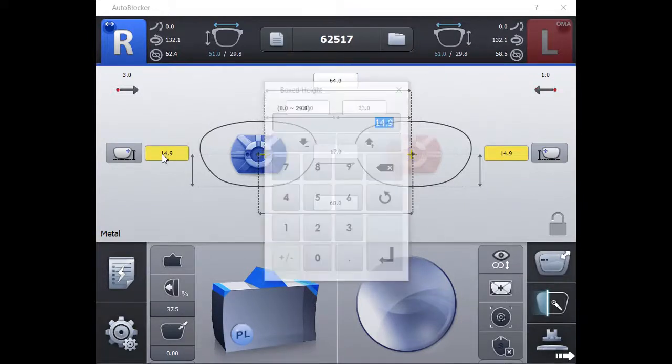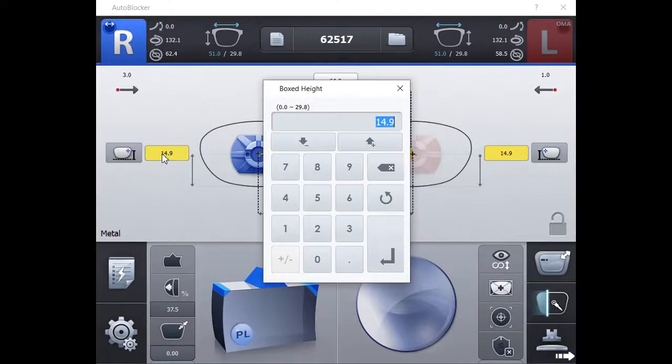The patient's boxed height can be entered. This is their OC height or SEG height or fitting height.